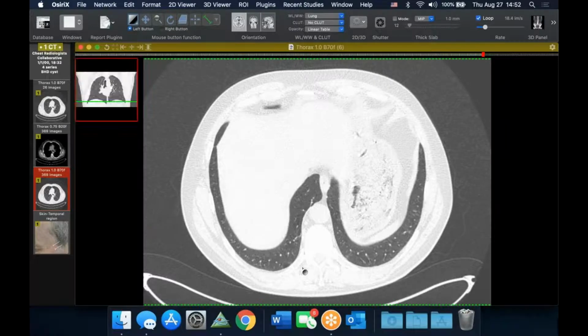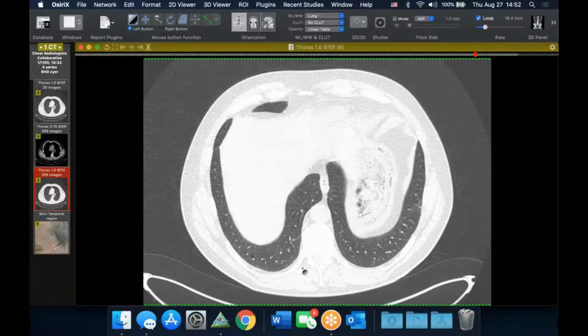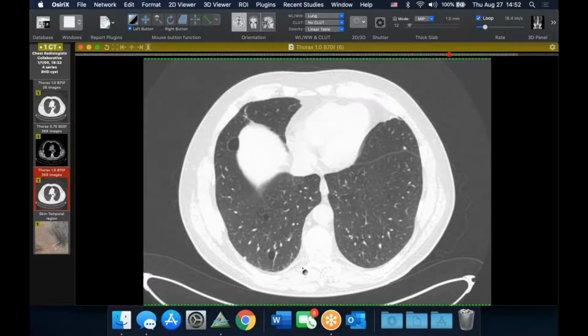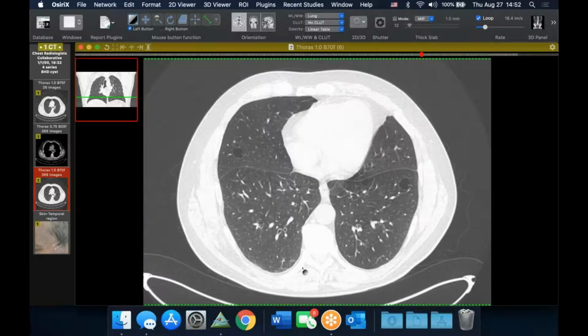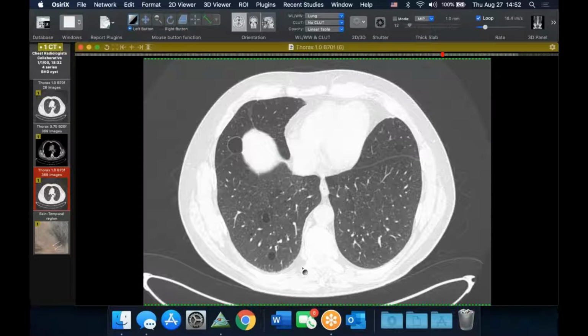But you can diagnose Birt-Hogg-Dubé sometimes, depending on resources, with a combination of chest imaging. So in this case, I think the chest imaging informs the diagnosis and makes it easier to think about this disease, because it is pretty rare. It was very popular in the mid-2000s when the first radiology papers came out, but I don't think we had a gene test quite then readily available. So I'm not sure how many people were Birt-Hogg-Dubé that really aren't. I don't know. But anyway, it has implications, of course, for screening for renal cell carcinoma, genetic counseling. Of course, these are older patients, so less genetic counseling just for any children they have. But yeah, just two nice cases of Birt-Hogg-Dubé.